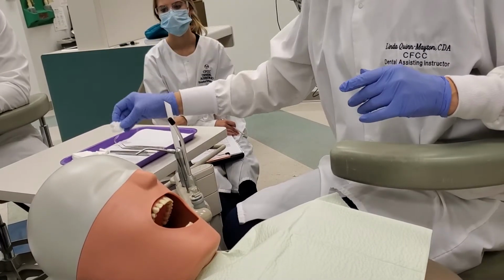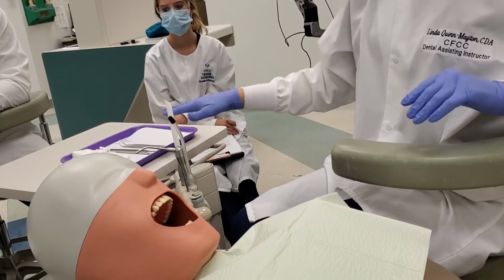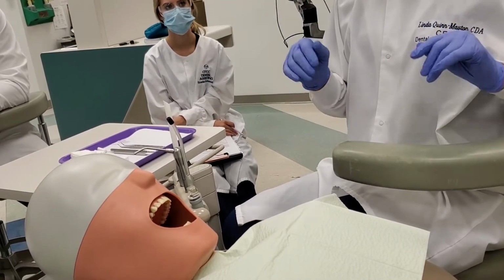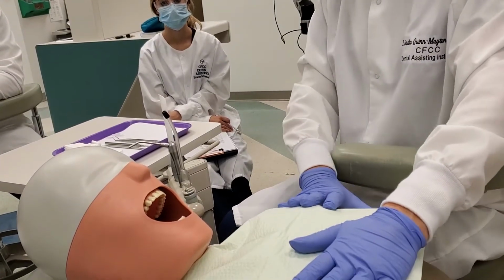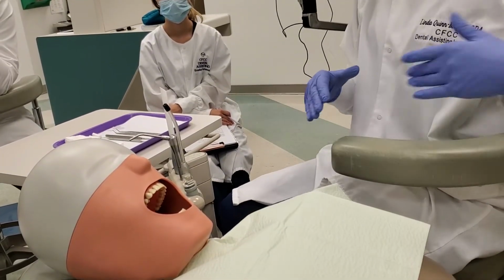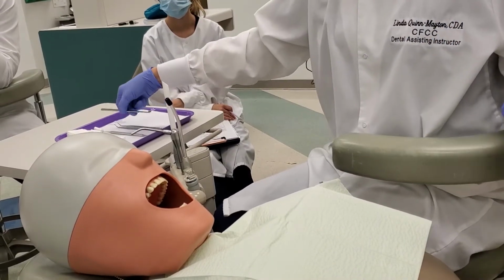Everything's over there on the cart. That's where all the stuff is, except for the instruments, obviously, but we'll get to that. The first part of the assessment is retraction. What this does is teach you what you can use for retraction.